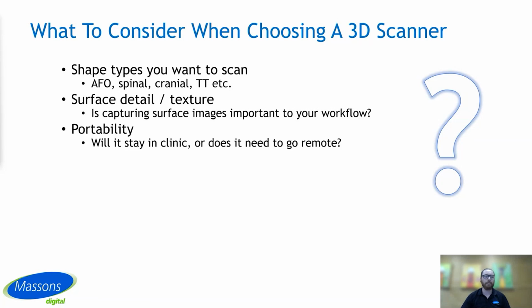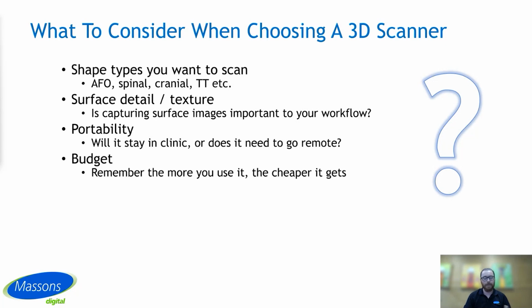We also want to think about the portability of a scanner. Are you keeping it in the clinic? Are you trying to travel with it? Do you need power points? Is it completely wireless? So based on where you're planning to do your clinics and where you're planning to do your scanning, that can be an important factor in choosing which scanner to use. Probably one of the most important ones that you'll come across is your budget.